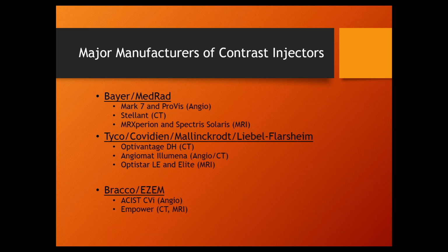Very good company, very good injectors, but they do not work and play well with others. They won't sell you anything. They won't send anybody out to you if anything breaks. They won't sell you any parts, anything. Anything goes wrong with your Bracco injector, they make you send it in, box the whole thing up. A power button, literally, a little plastic orange one, they won't sell it to you. Now, there are some Bracco service reps in the cities, and if you're in good with them, they'll say, here you go, stuff like that. But in general, again, nothing wrong with the company. They're very, very good injectors. But they don't work and play well with others.